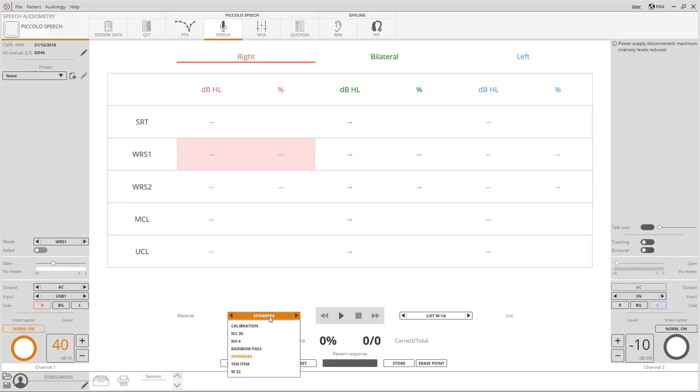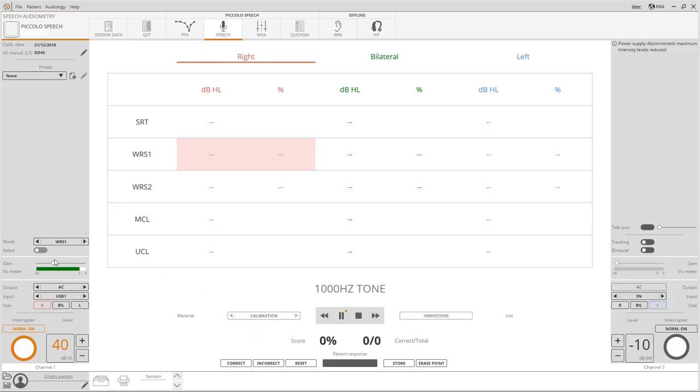Before continuing with the settings we now need to check the speech inputs initial gain to be sure of the intensity's effectiveness. To set the initial offset move the gain cursor.